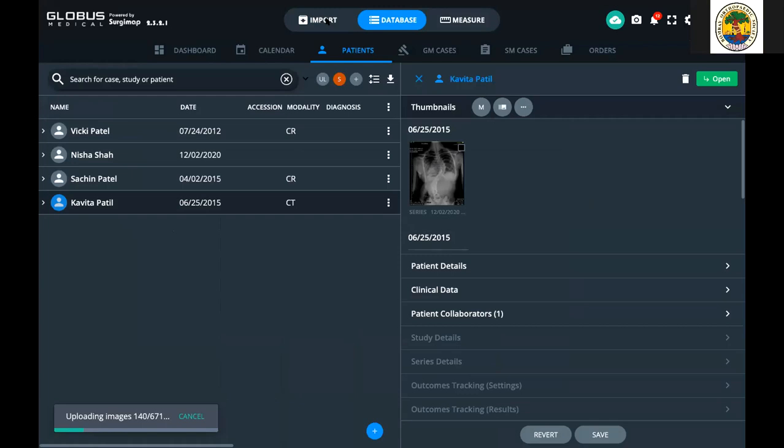So just skip Kavita Patil. Try Vicky Patel. Same again, when I click on it, I see all the three. I think it's a full length X-ray, right? So I'm unable to drag the entire thing in. So are you dragging the images or are you dragging the folder? I'm trying to drag the folder. When you drag the folder into the import area, when you go in there, it opens import, click here or drop images, desktop, download, hospital packs, right?